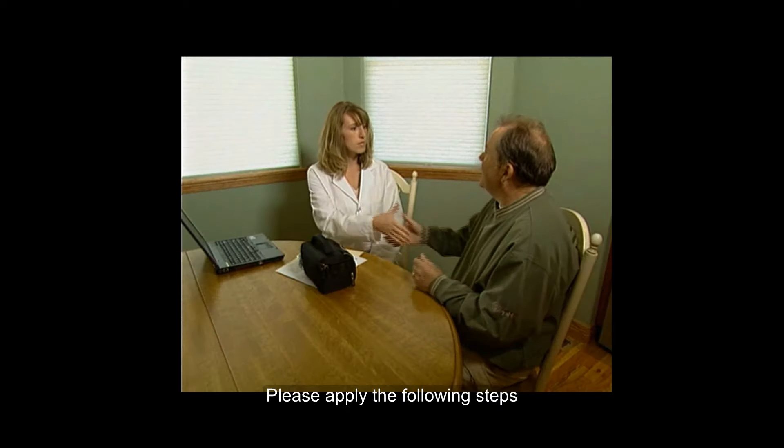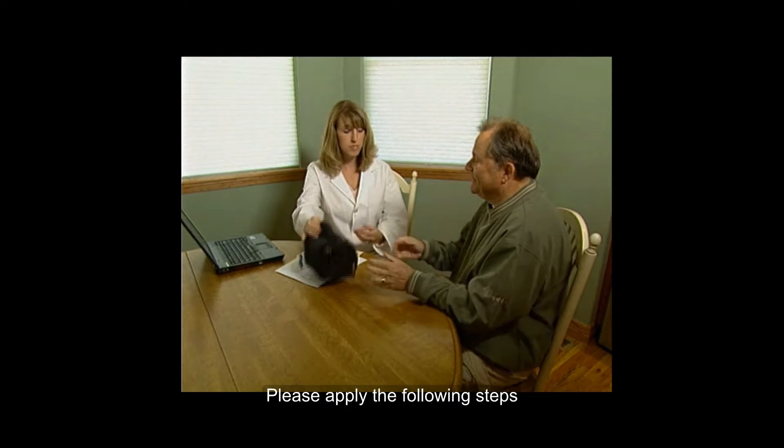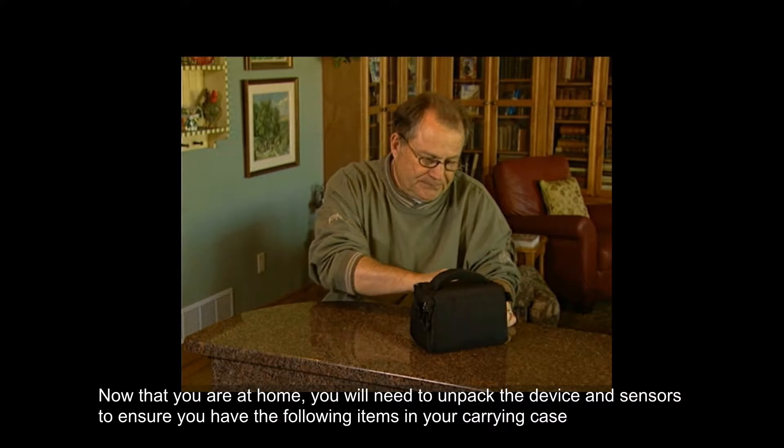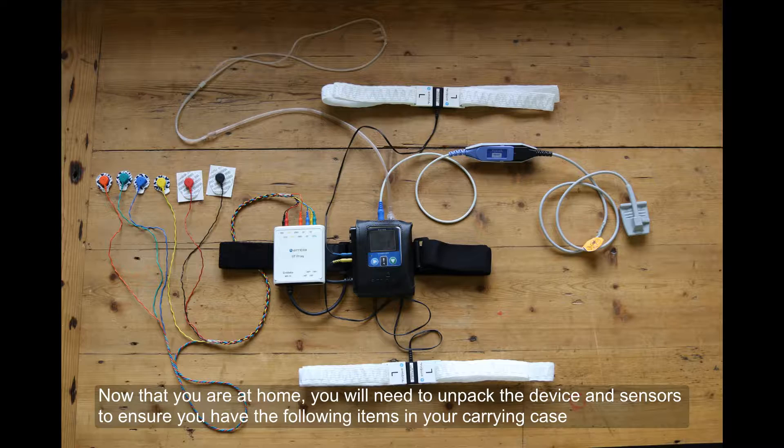Please apply the following steps. Now that you're at home, you will need to unpack the device and sensors to ensure you have the following items in your carry case.